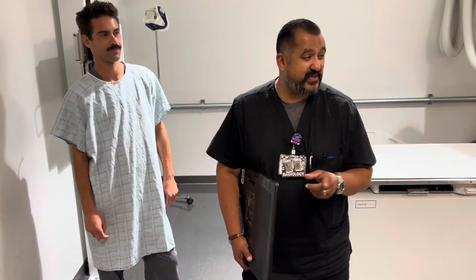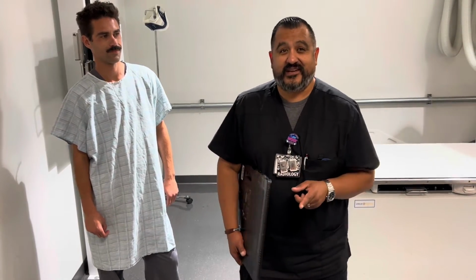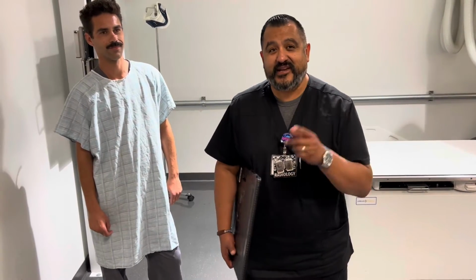These are one of the projections that people don't like to do, the ribs. Okay, but who doesn't like ribs, right? So let's go ahead and get started.